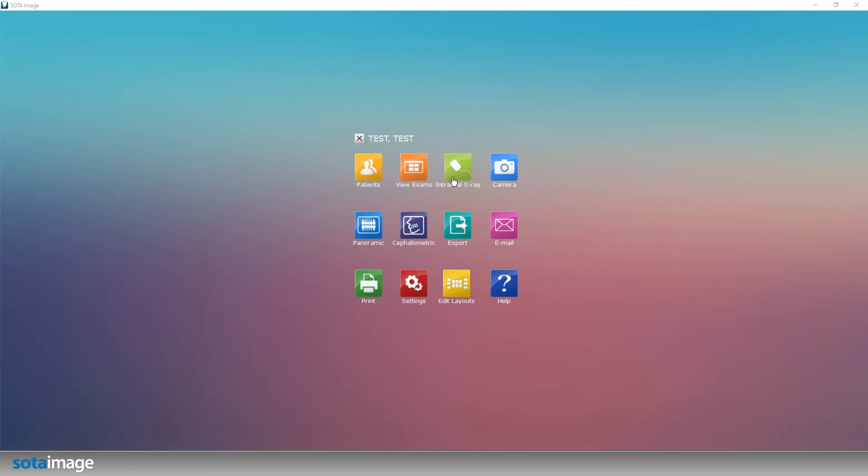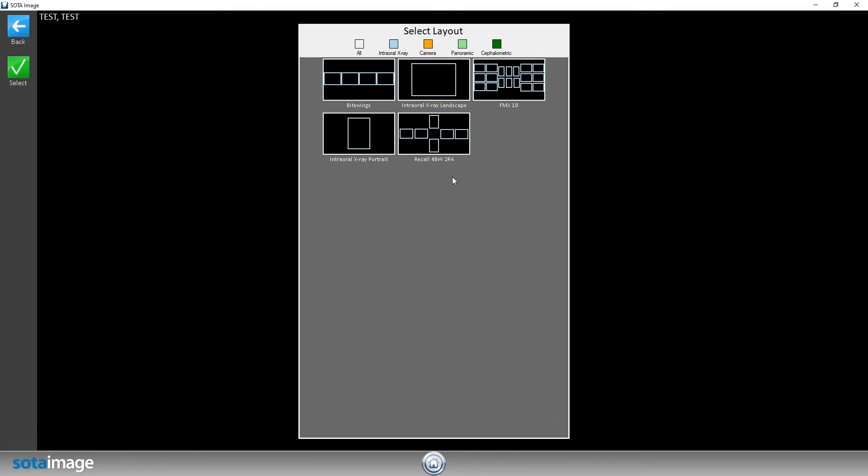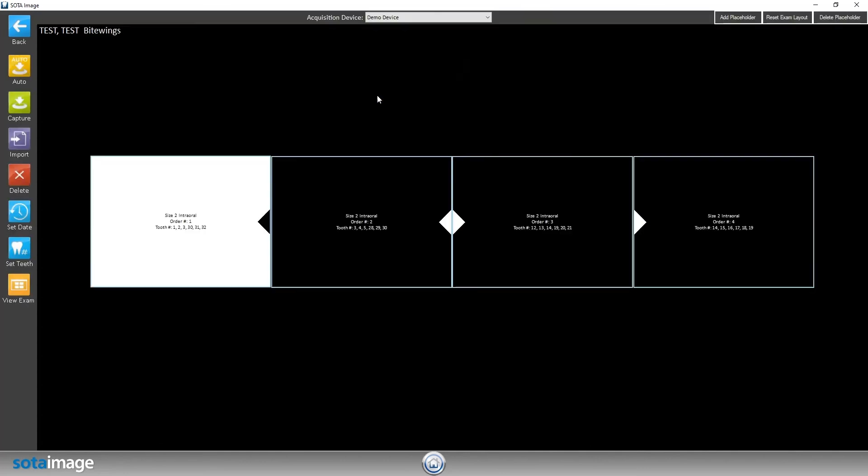I'm going to click on intro x-ray and find the exam layout that best fits whatever exam you want to put in. In this case, I have four bitewings, so I'm going to choose the bitewings layout.